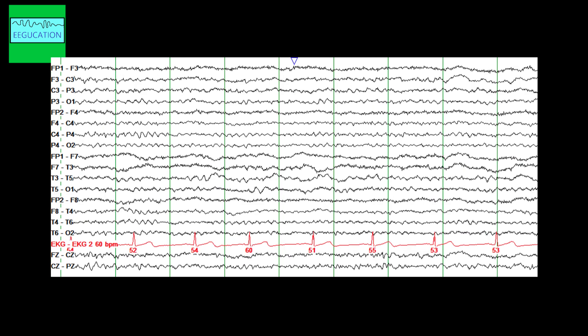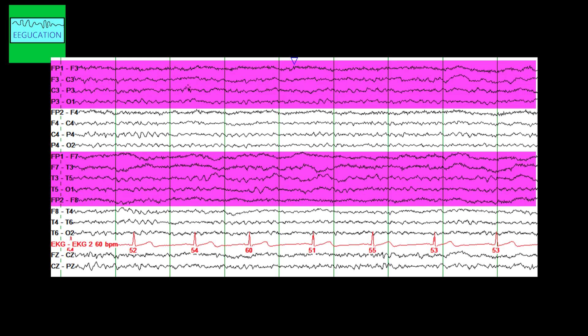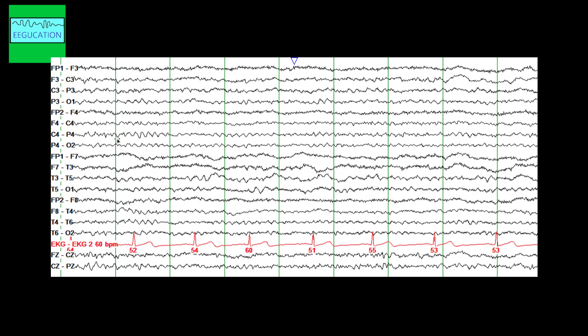This is another EEG: somebody comes in with a seizure, the CT and MRI are normal, but right after the seizure you do an EEG and find lateralized slowing. In this case, you see slowing compared to the left hemisphere — the right hemisphere still has some well-formed rhythm while the left hemisphere shows almost persistent slowing. If you see persistent localized slowing in the absence of a structural abnormality, you can consider post-ictal slowing — the area generating the seizure can show slowing for quite some period of time.